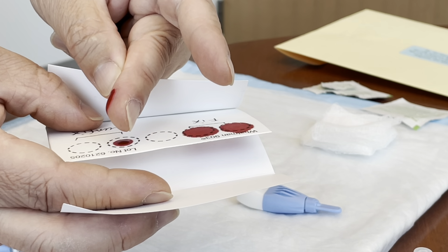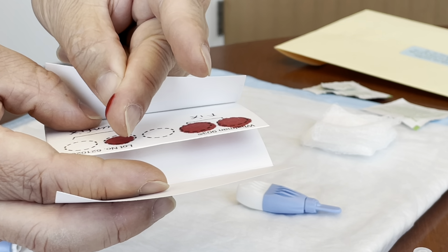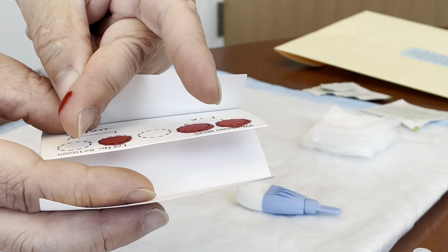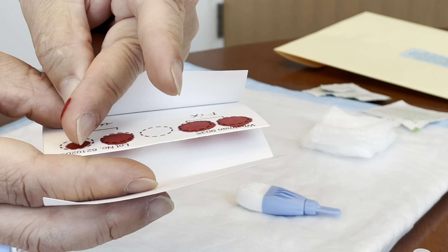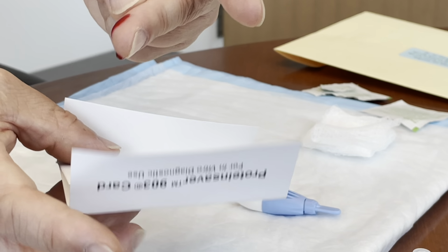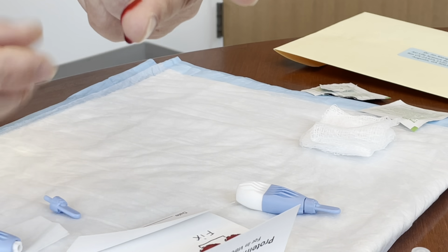Skip the third circle, that one will remain empty, and move on to the fourth circle. Add as many drops of blood as needed to the fourth circle to fill it to the edges before you move on to the fifth and last circle on the card. If the blood flow is slowing down or not coming easily, you can set the card down and use your other hand to squeeze or massage the finger from the palm towards the fingertip to stimulate more blood flow.